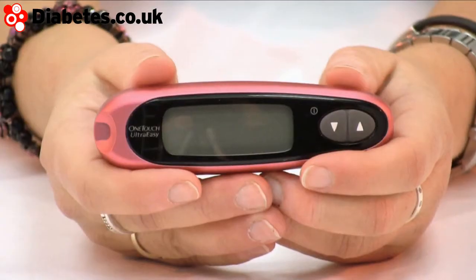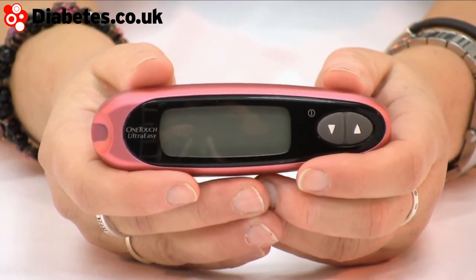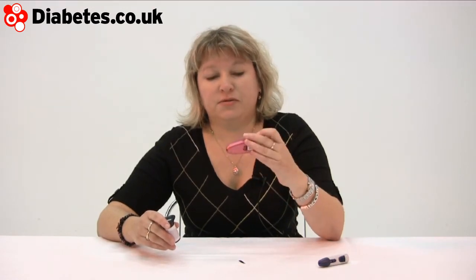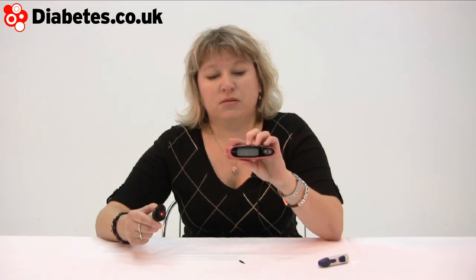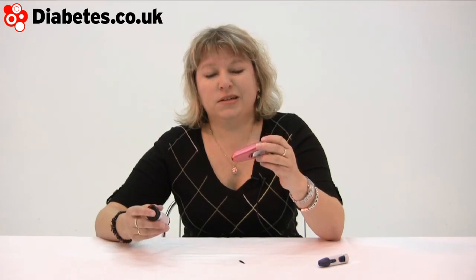It comes in a range of colors — I do like this snazzy metallic pink, it's most groovy. They are very nice to hold and very easy. Different people have different feelings about screen sizes; some people like really big digits, but if you're not hard of sight then maybe you don't need a big screen. This is quite discreet — I wouldn't say it looks like a phone, but it doesn't look medical, which is nice.